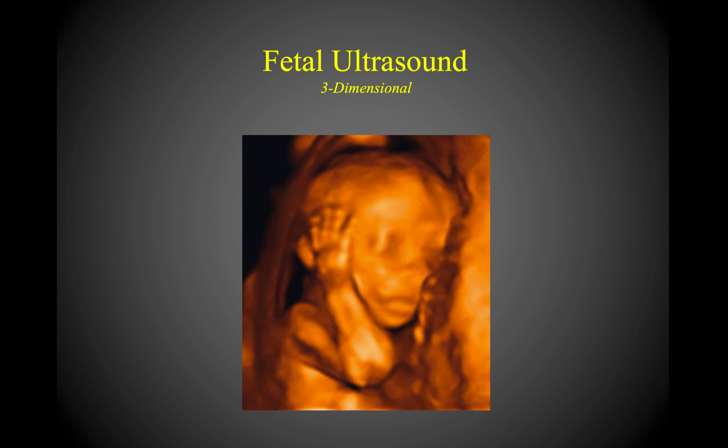And then we also are able to perform three-dimensional ultrasonography now. Generally, we don't use it on a traditional pregnancy. The reason is that ultrasound does heat up the fetus relatively significantly, and so we try to stay away from doing that as much as we can. There are a fair amount of commercial entities, though, that do this 3D ultrasound. You can see it produces a pretty cool picture. It can be really useful, though, if we do detect any abnormalities via conventional ultrasound. It's usually helpful to then switch over to a 3D ultrasound to get a little bit more detail of what's going on with the fetus. So again, you can see how this would be quite useful diagnostically.